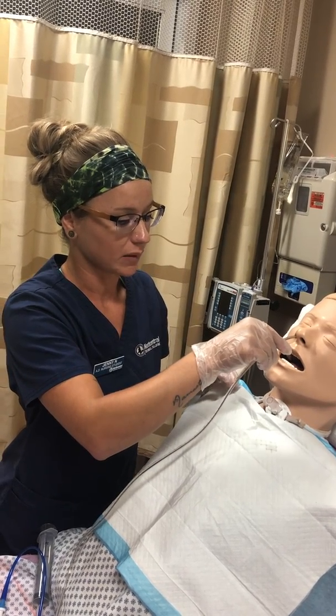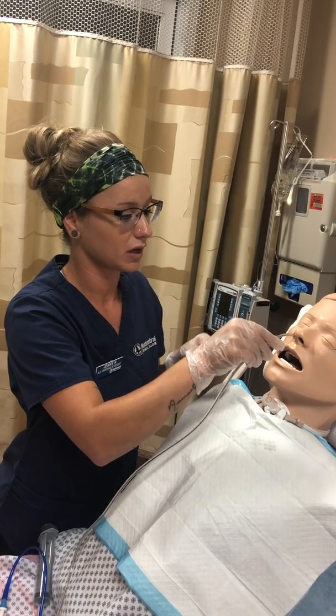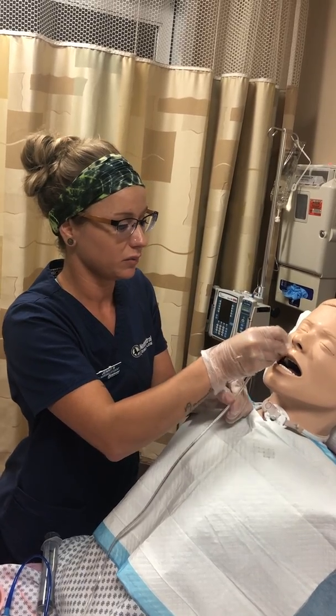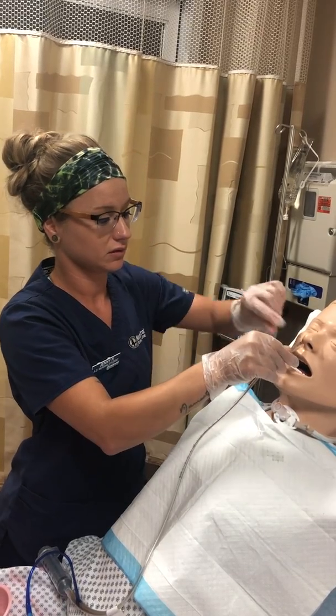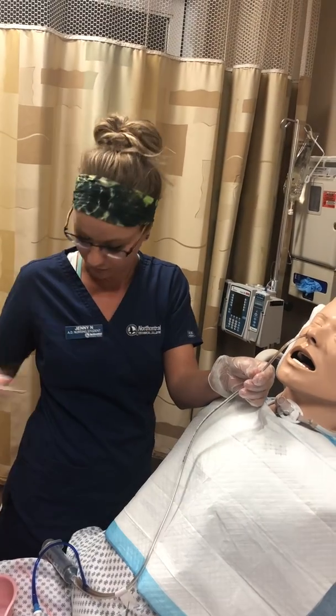And at this point, I'm going to have her drink her water or assist in swallowing. And as she's swallowing, I'm going to gently insert 5 to 10 centimeters with each swallow. Keep swallowing, Jennifer. Keep swallowing. You're doing great. Okay, I reached my 50 mark. So I'm going to grab my piece of tape.